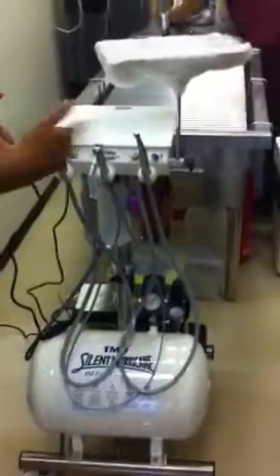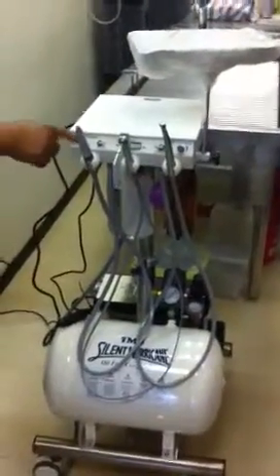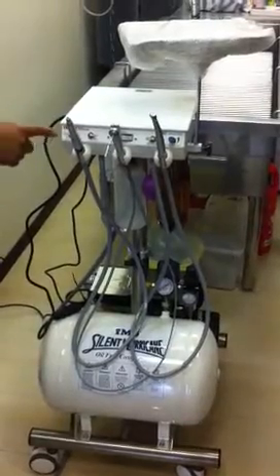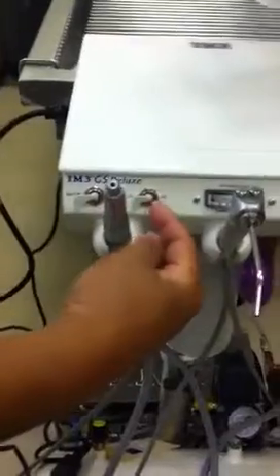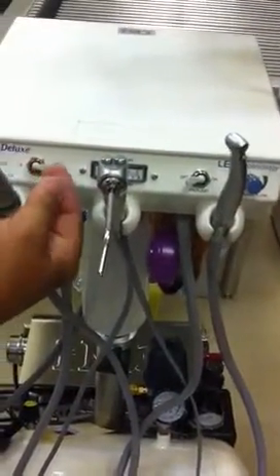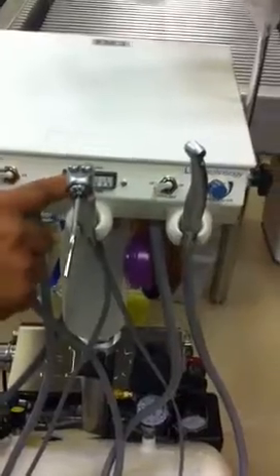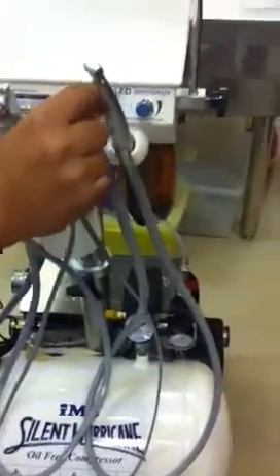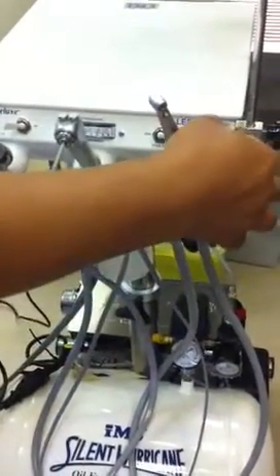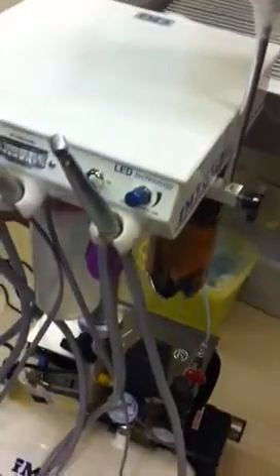Back to the orientation of the front. This is the solution switch, whether you want to select water or CLS solution. This will be a selector for low-speed or high-speed handpiece. And this will be a pressure gauge, I will explain later. Coolant on/off is a switch to pressurize the bottle. When I power on, you will understand.